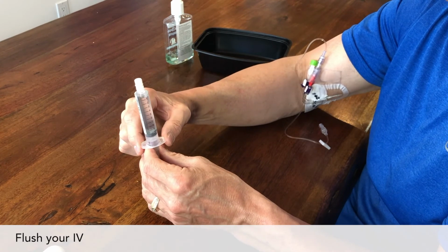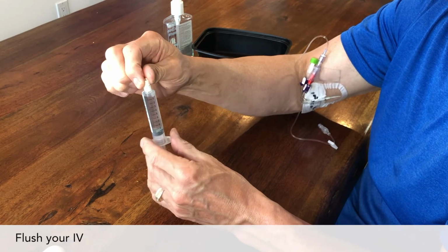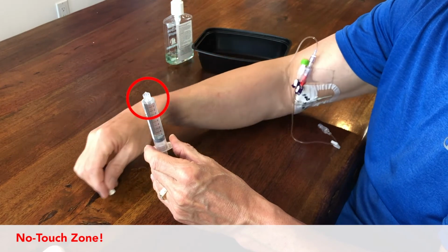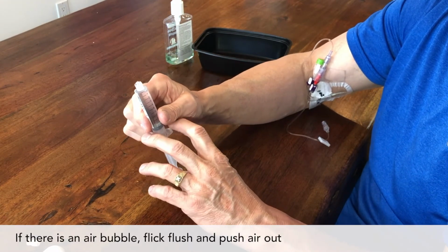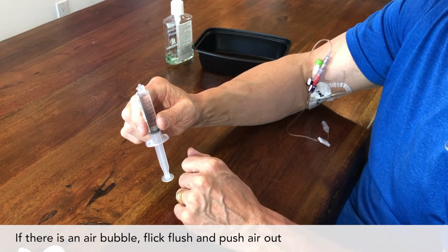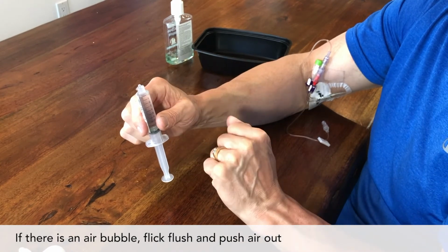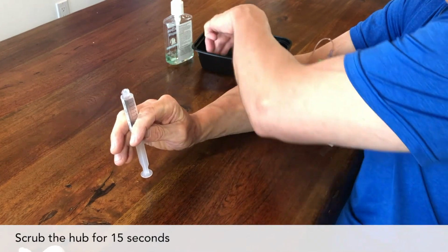If you were told to use 2 flushes, prepare your second flush. We're only using 1 flush. Take the cap off. This tip of the flush is now a no-touch zone. If you see there is still air in the flush, flick the syringe to push the air up. Then push the tail end of the flush until all air is out of the flush. Open the alcohol swab.